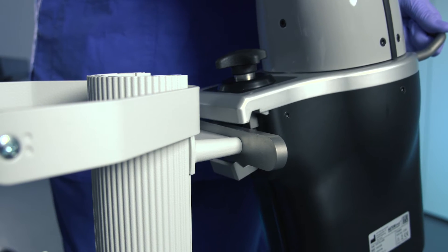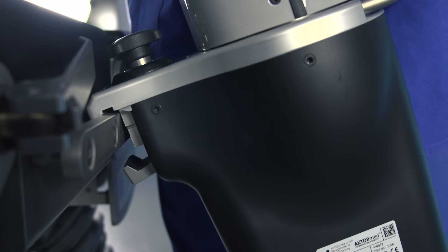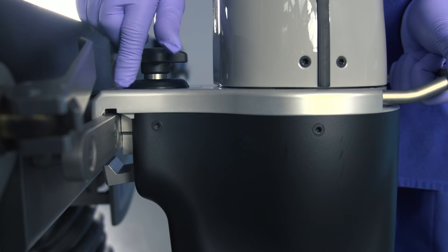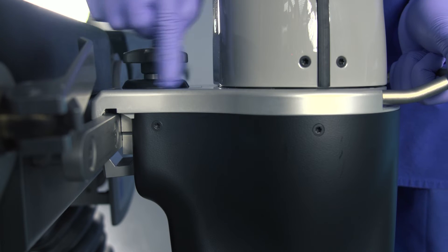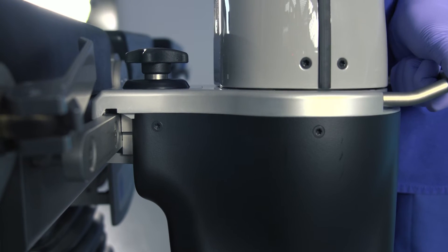Unclamp the Artip Solo from the trolley and mount the arm to the operating table. Secure the Artip Solo by tightening the clamp. Once secured, reconfirm the arm is fixed to the table and tighten further if necessary.